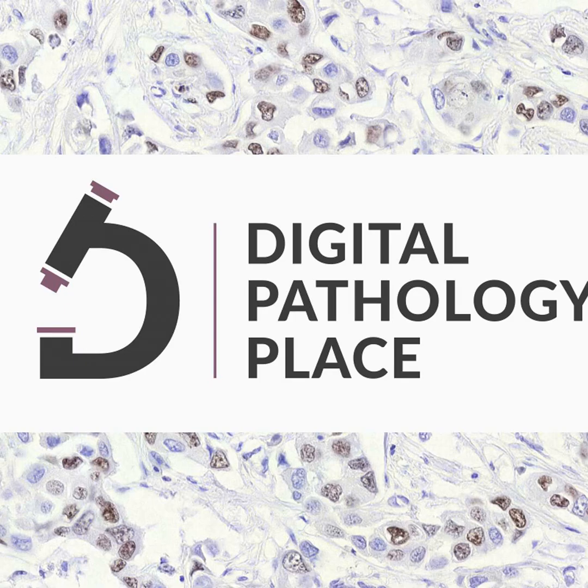I think that simple baseline is very important as well and can tell you down the line whether you're improving upon it. Something that you can keep rerunning if you change your data set, if you add additional data for some classes or get additional annotations, something like that. You can always rerun your baseline and see whether the more complex model that you develop later on can improve upon it. But without knowing how the simple model does, you don't know what you don't know.